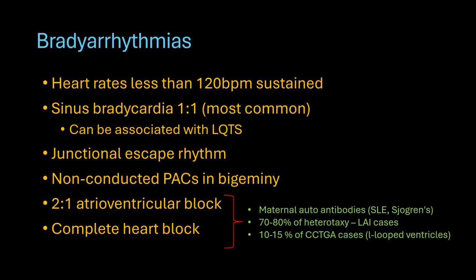Two P waves to one QRS, or two atrial contractions to one ventricular contraction, can cause the ventricular rate to be half of a normal heart rate. And also complete heart block, the same, where you have complete dissociation of the atrial activity and the ventricular activity, and the ventricular intrinsic rates are much lower than 120 beats per minute.